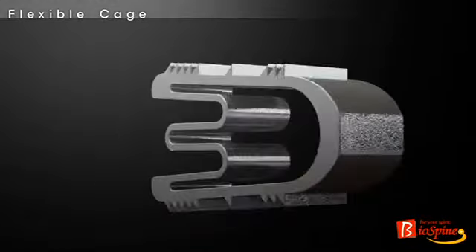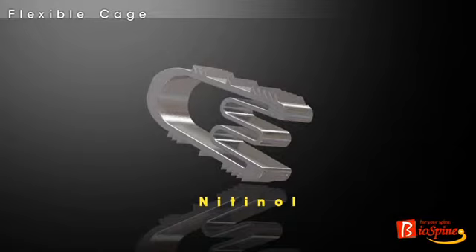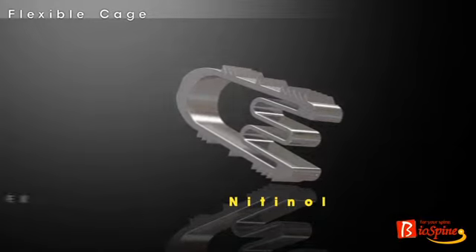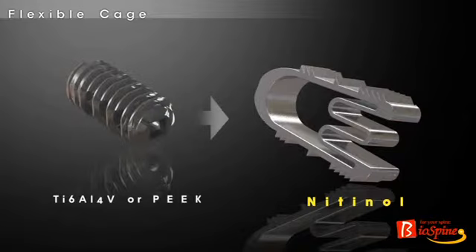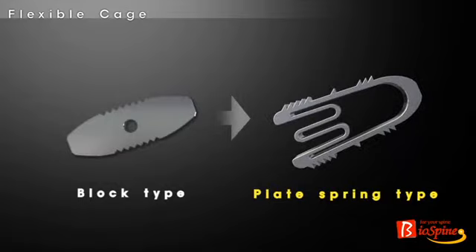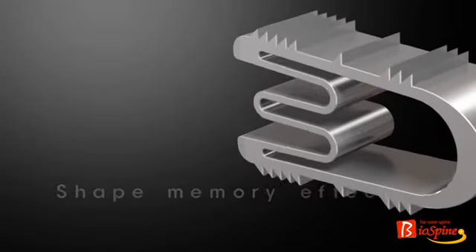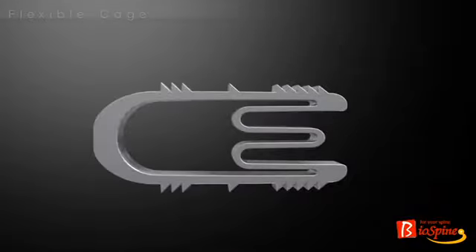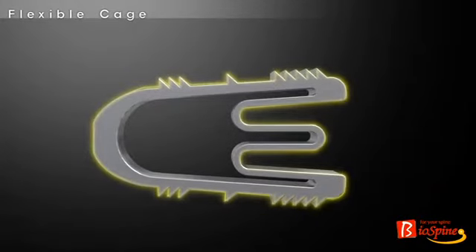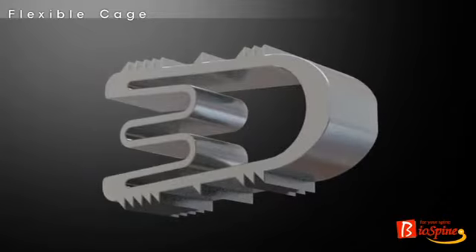The key features of the flexible cage are characterized by the originality from material and design. Nitinol, a shape memory alloy, has been adopted as the raw material of the cage instead of Ti6Al4V or PEEK. We have changed the functional design from the traditional block type to the plate spring type. Thus, the flexible cage can make the best of not only advantages in material, such as superelasticity and shape memory effect of nitinol, but also advantages in design, such as shock absorption of the plate spring. As a result, we invented the functional cage, differentiated and improved prominently in terms of flexibility.